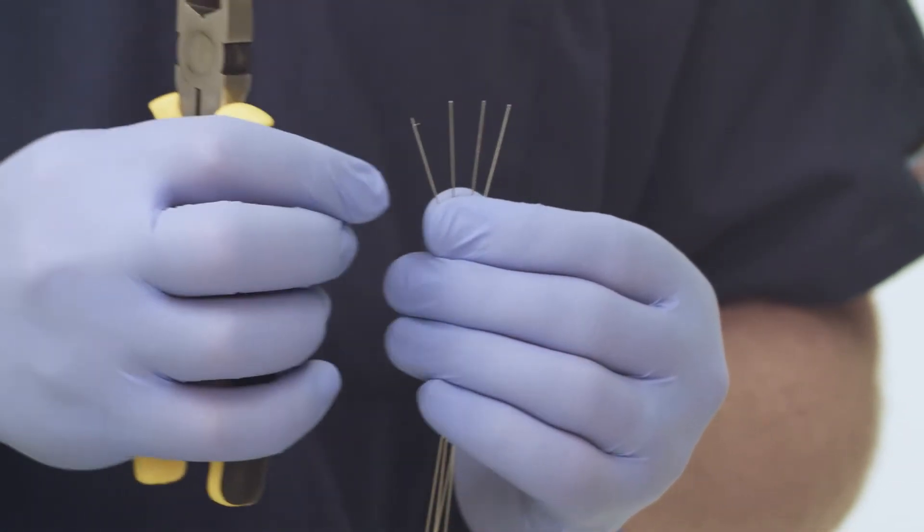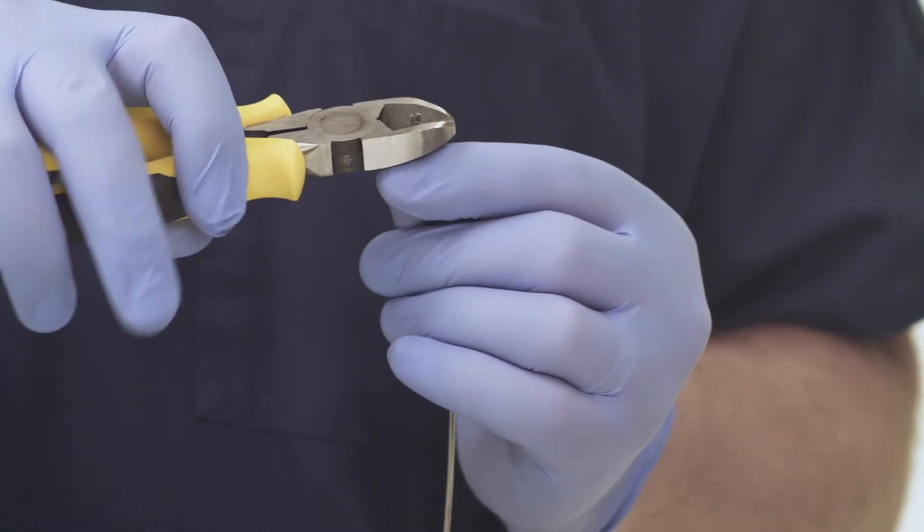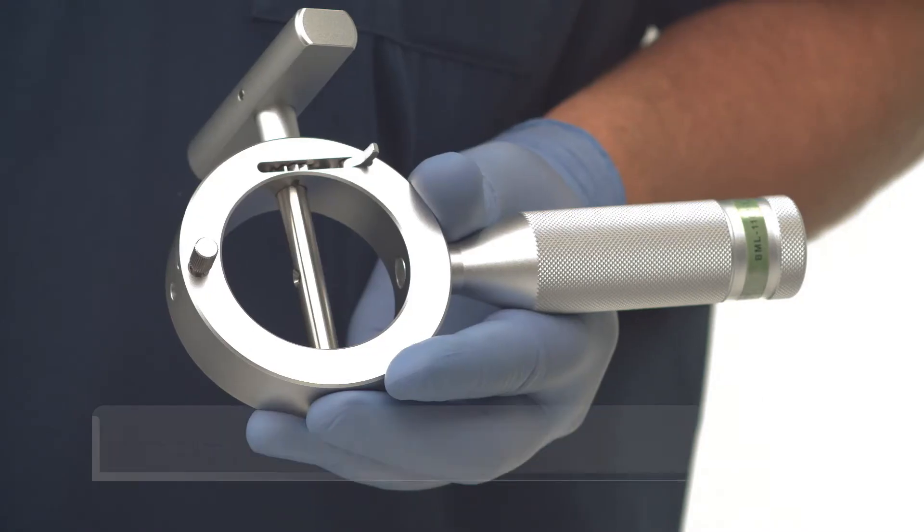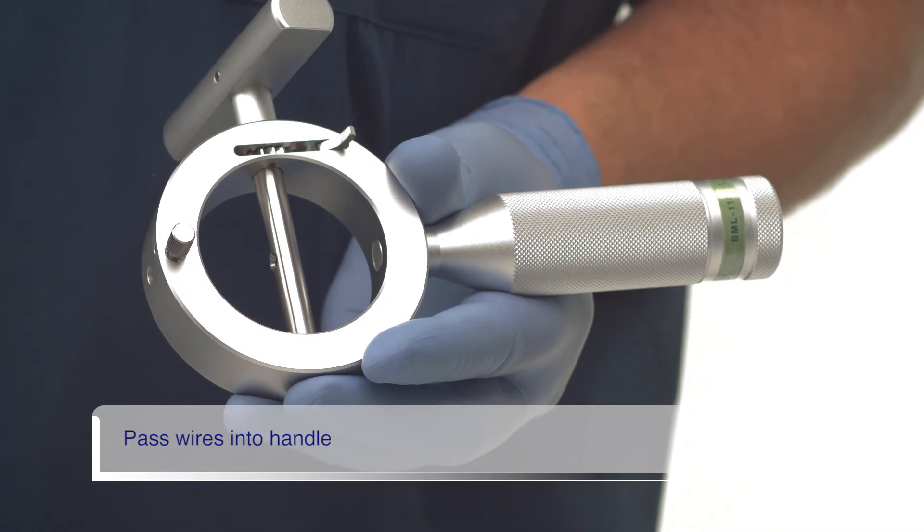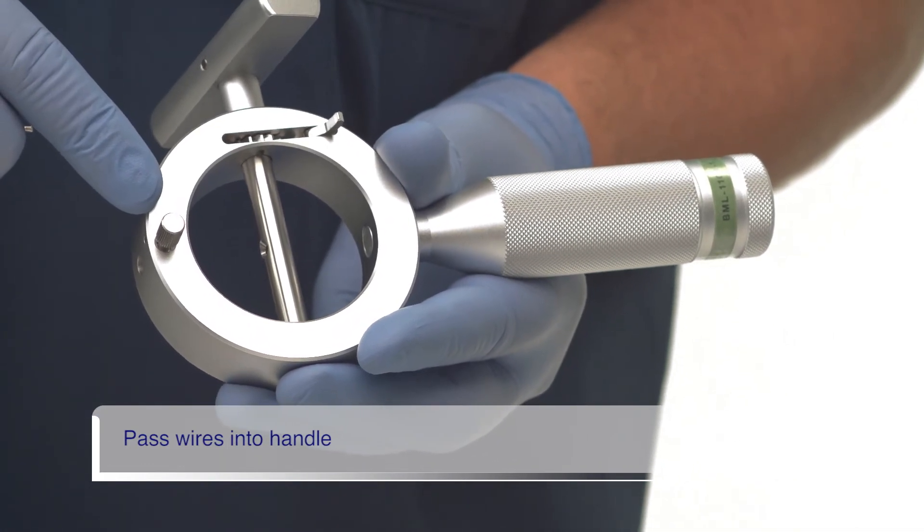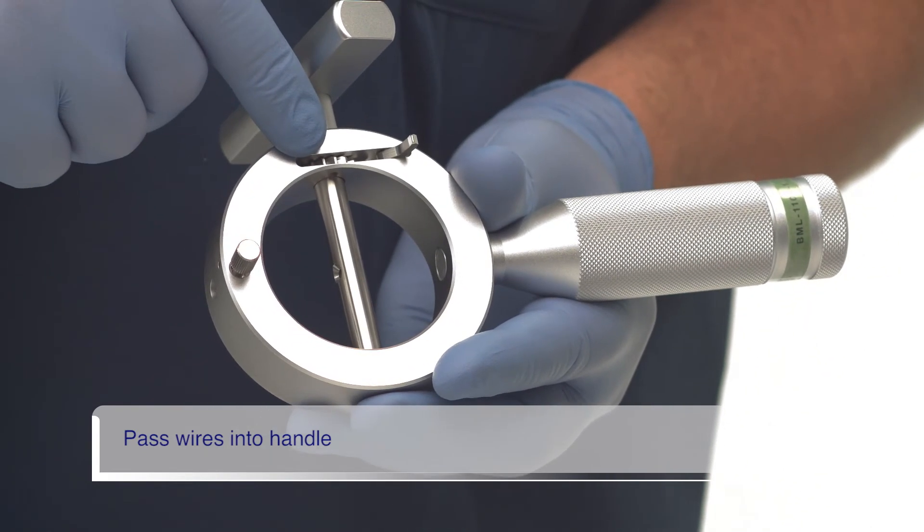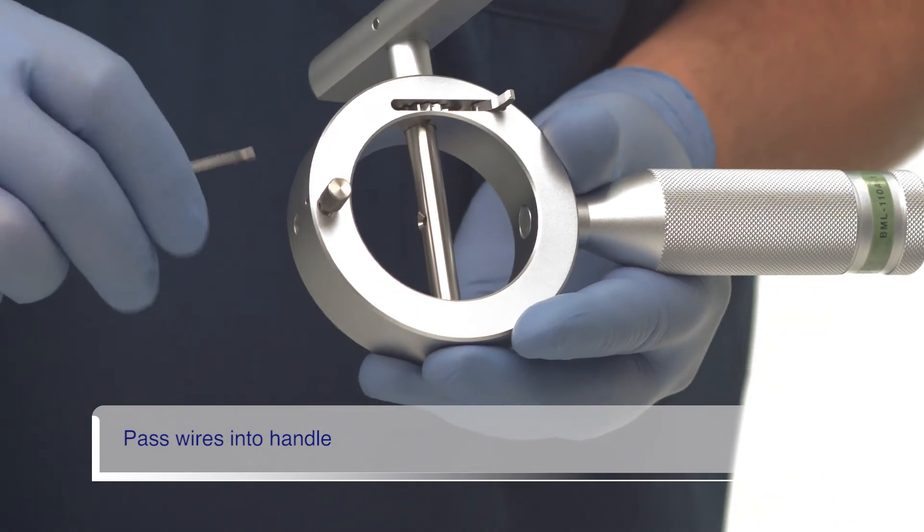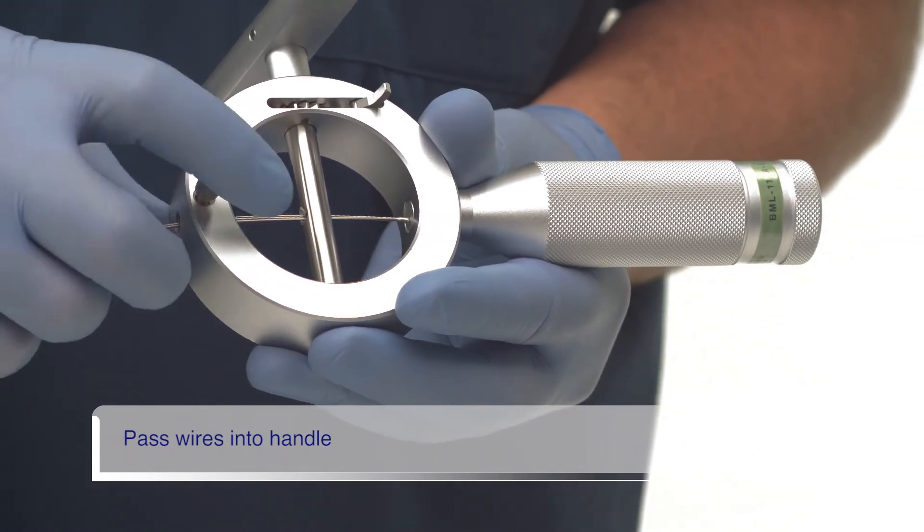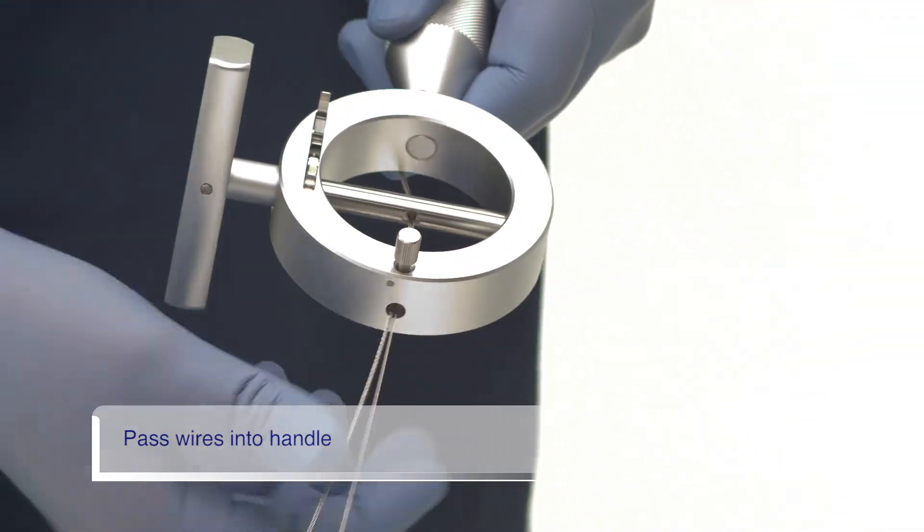If any wire ends have become frayed, trim them with the wire cutters. We will now load the wires into the emergency lithotriptor handle. Note that the emergency handle has two locks. One is a thumb screw that secures the coil sheath and the second is the ratchet lock which we tested earlier. The wires are passed through the hole at the top of the handle and through the hole at the center of the T-piece.